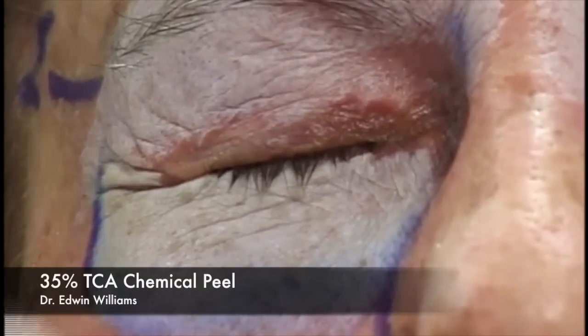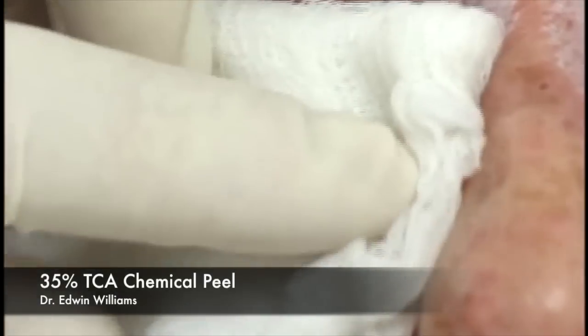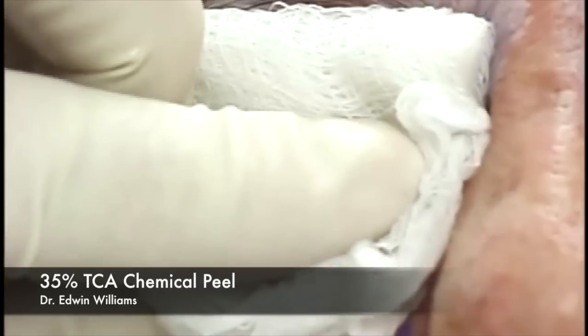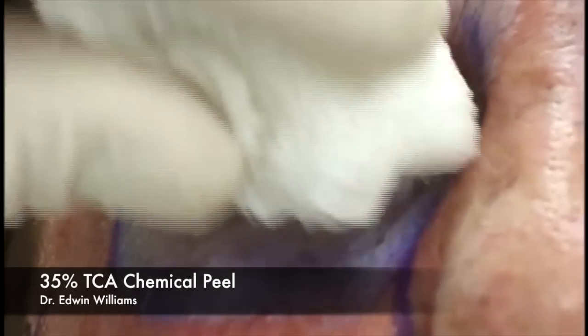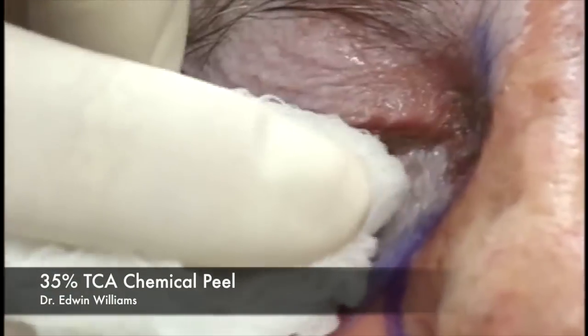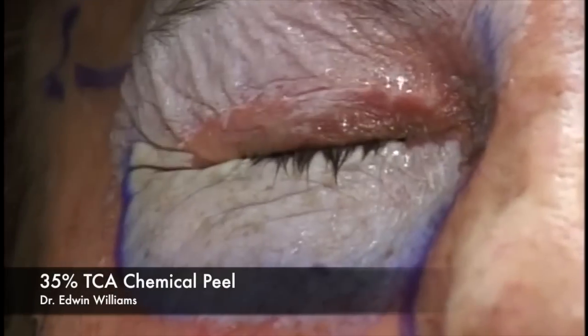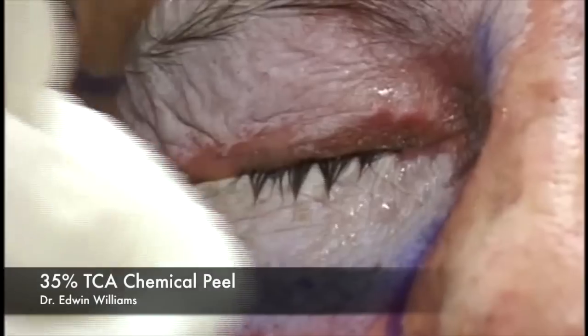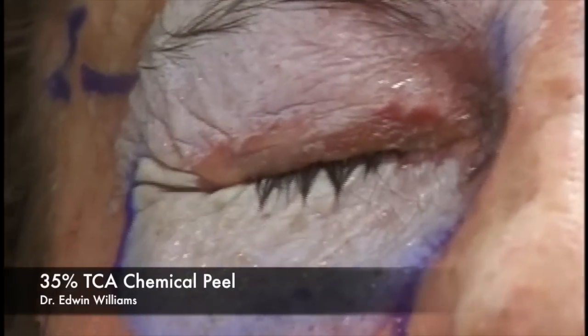Once we see a nice whitish frost, we apply the cold pack. Although we talk about this as neutralizing the peel, it doesn't truly neutralize it—it just dilutes the solution to the point that it's ineffective. It's also very soothing, and we want to stop the peeling once we've reached a nice reticular dermal injury.